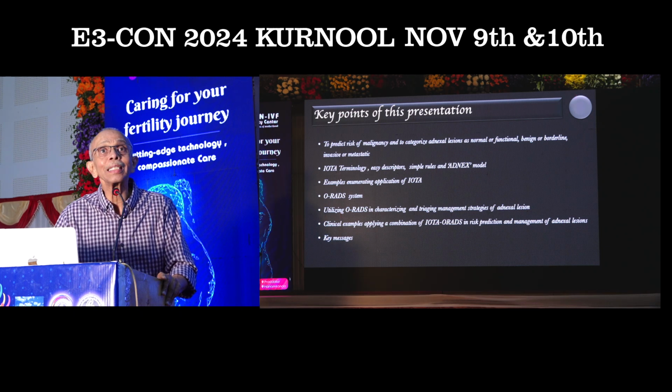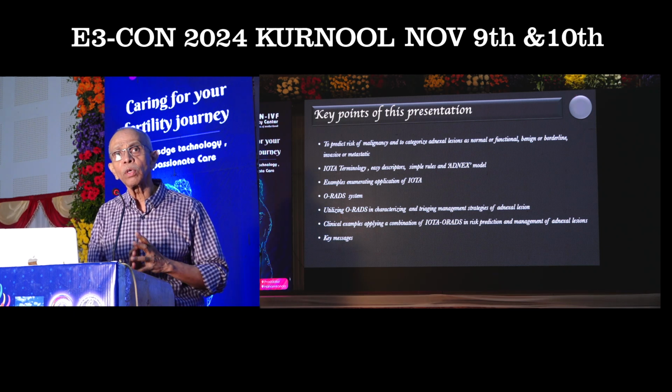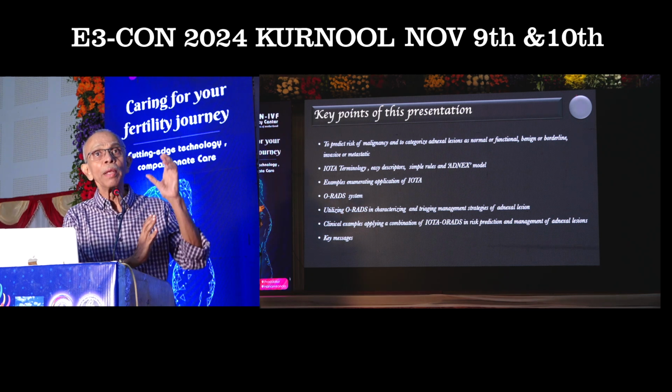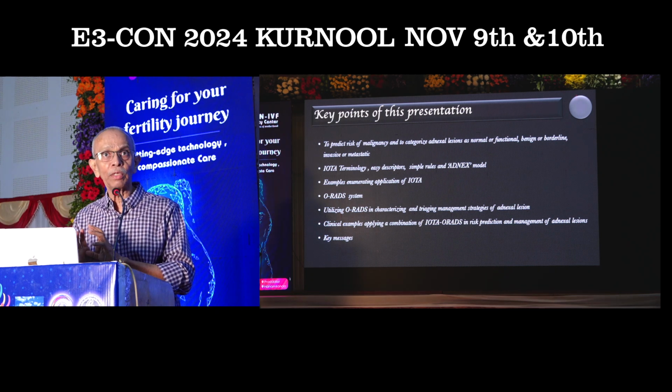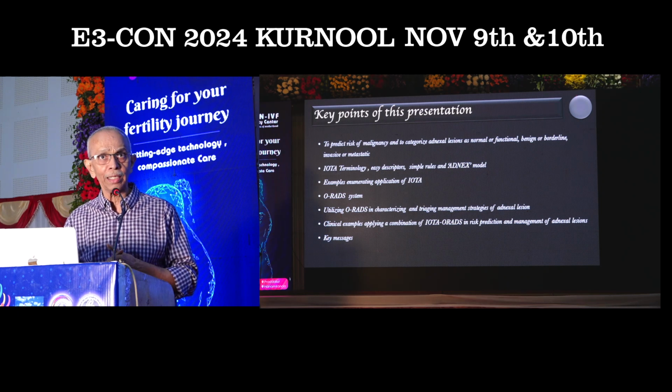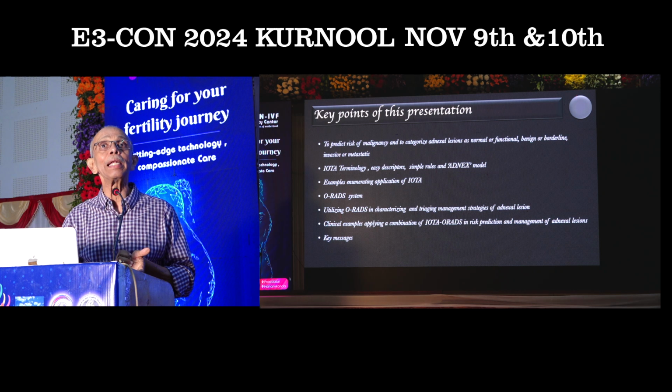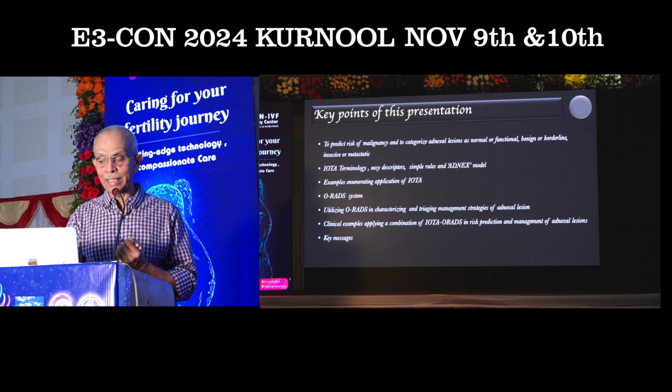Then come what are called the simple rules. They have come forward with simple rules, that is, each of the adnexal lesions will have certain benign features and certain malignant features. Based on that also you can categorize these lesions. Then last and the most important is what is called the ADNEX model, which I will take you through by giving you some examples.